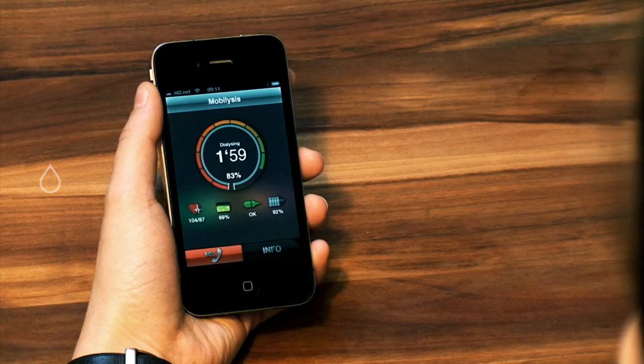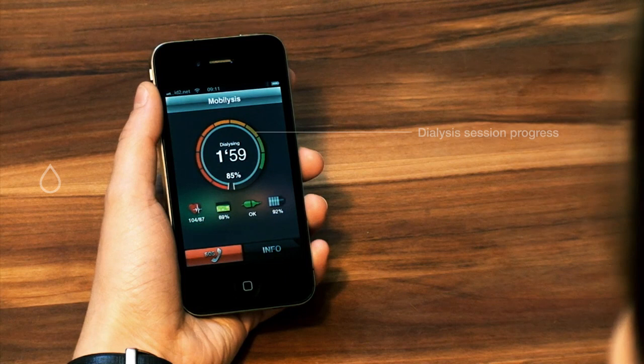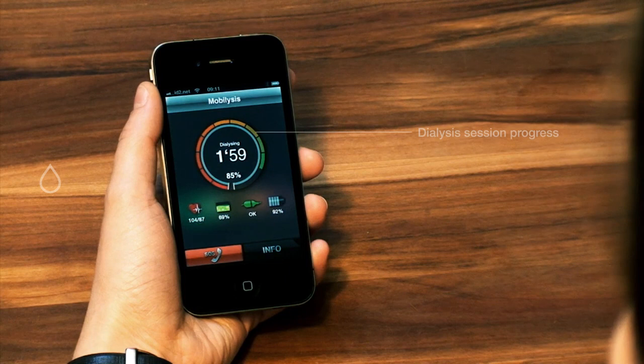Every dialysis session is divided into multiple cycles. The colored circle segments inform you about the state of the current cycle. The numbers in the middle of the inner circle represent the progress of the current cycle as well as the remaining dialysis time.